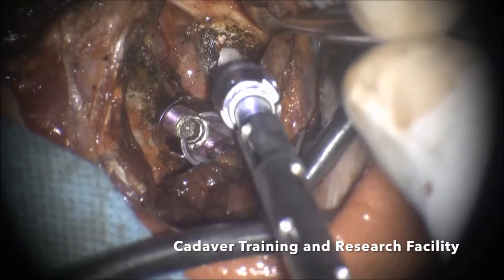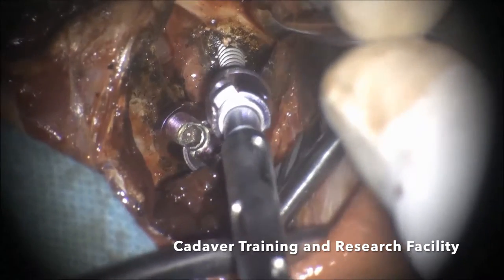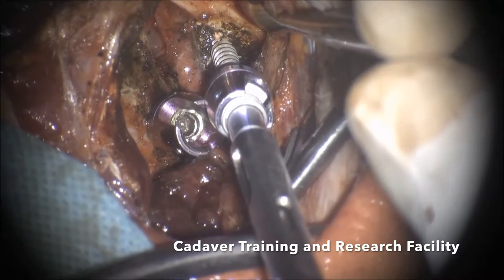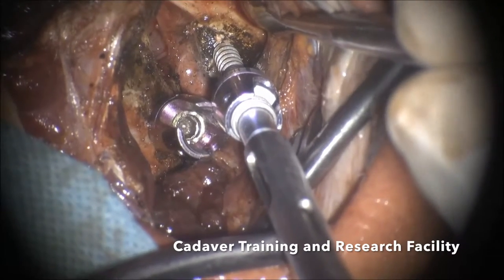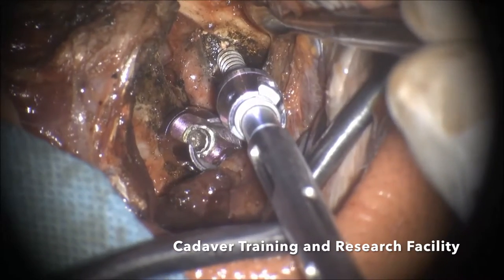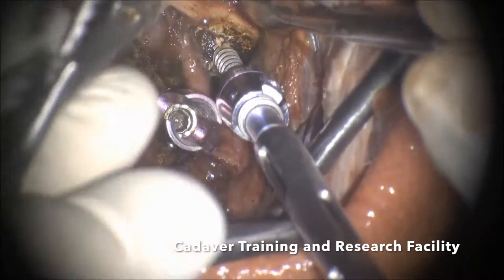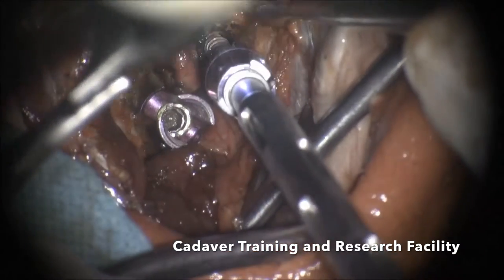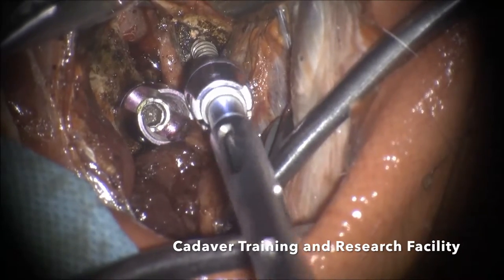For this C1 screw, you have to pull C1 slightly upwards — upwards meaning backwards. Whenever you are putting a C1 screw, this step is very important: you have to take an Allis forceps and hold the arch, because if you are going to push while putting the screw it can cause significant cord compression. So you have to hold it and your assistant has to counter-pull it upwards when you are inserting the screw.